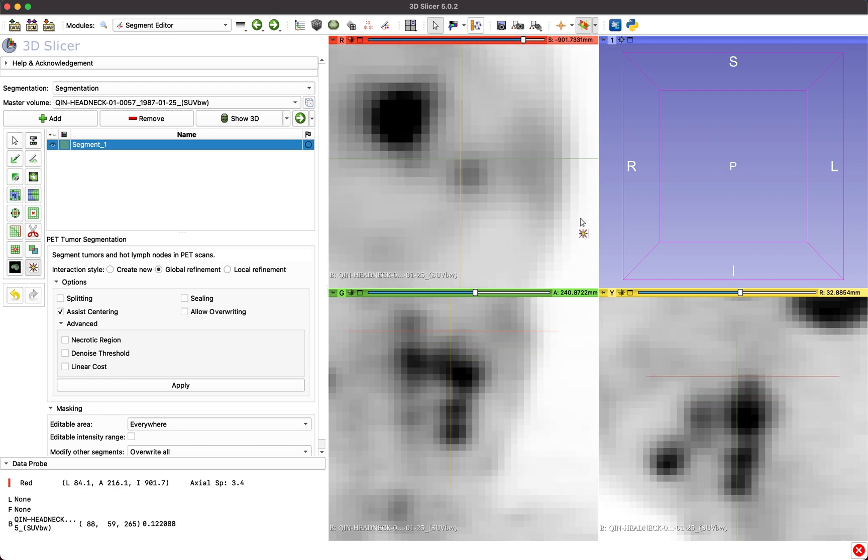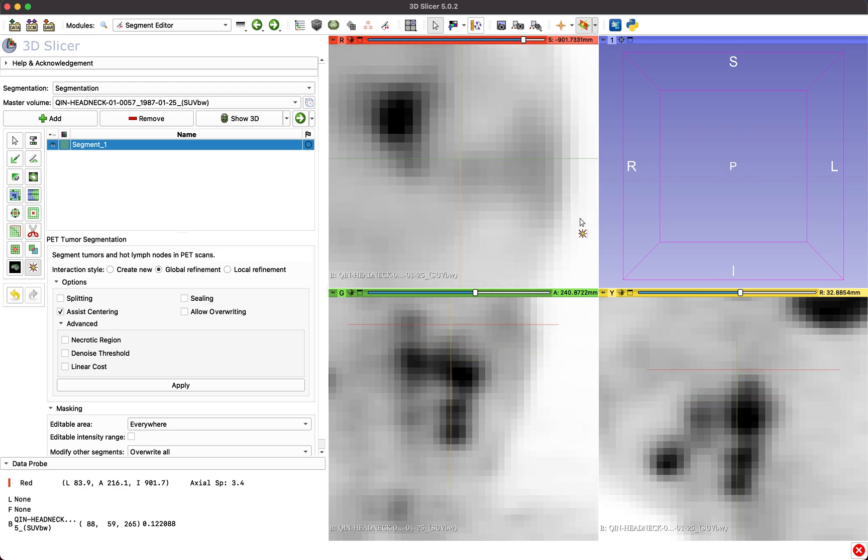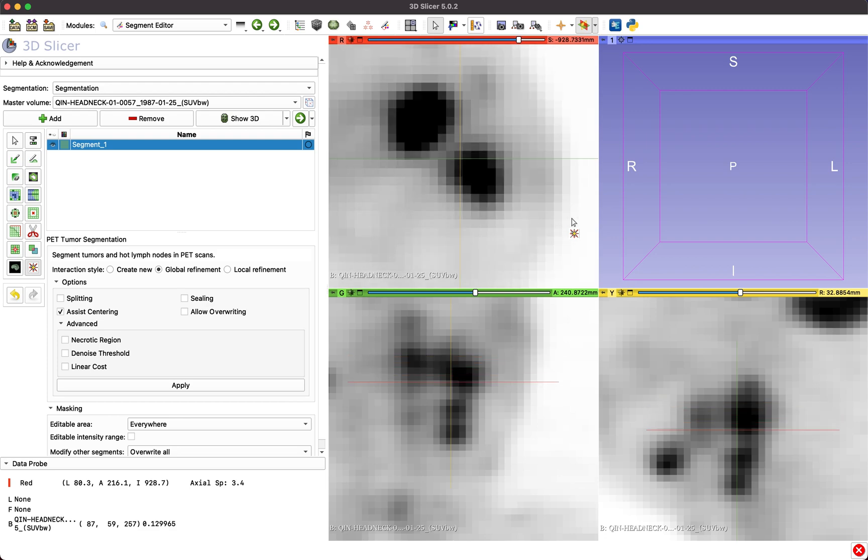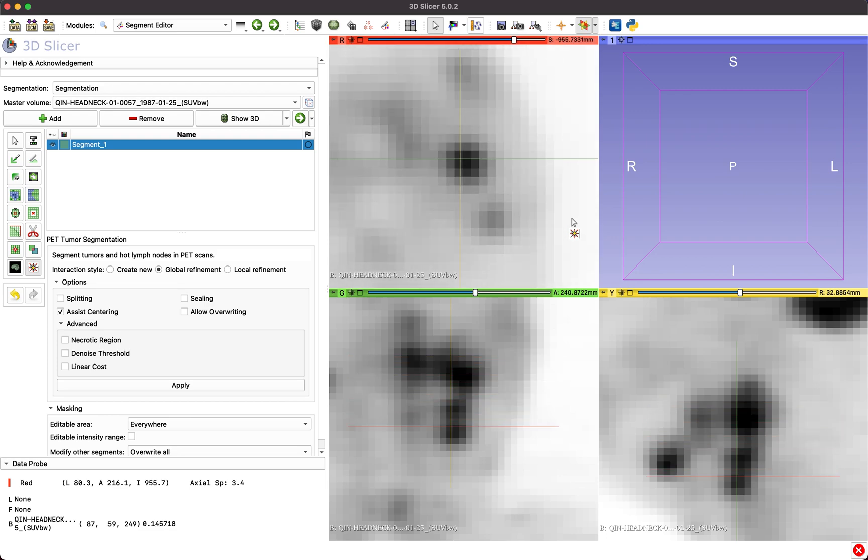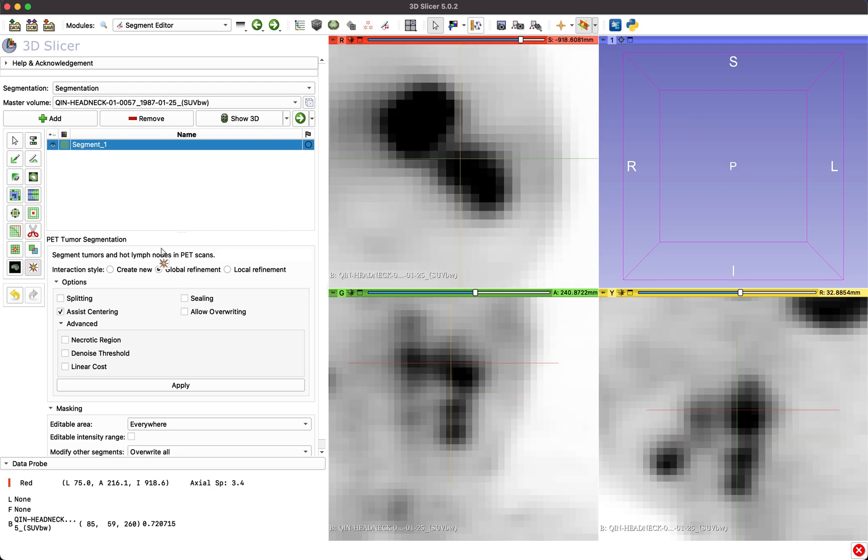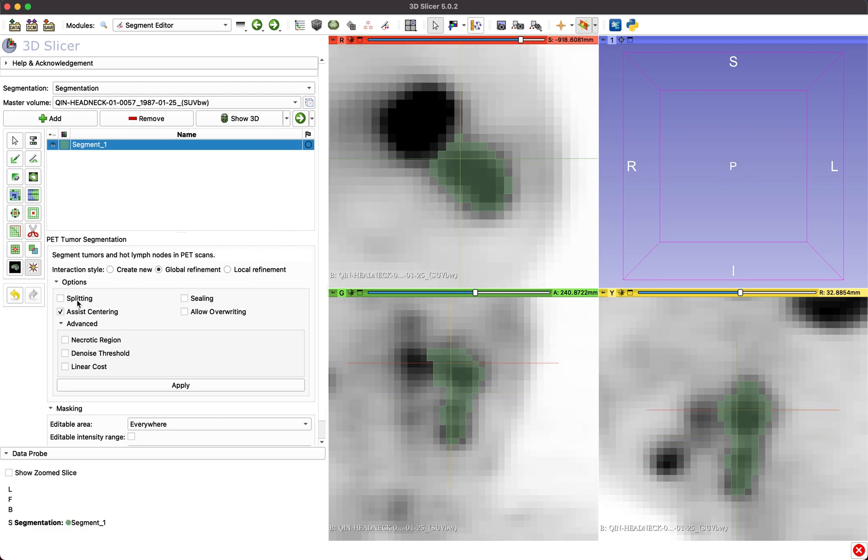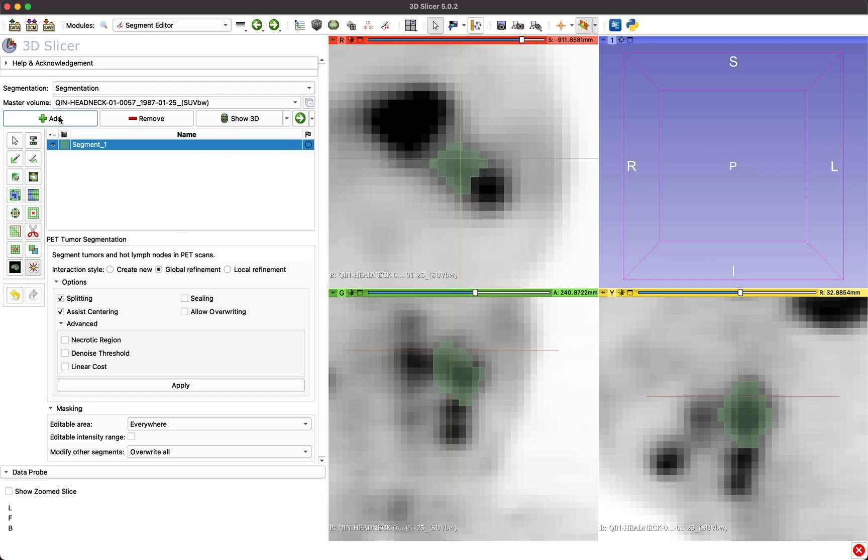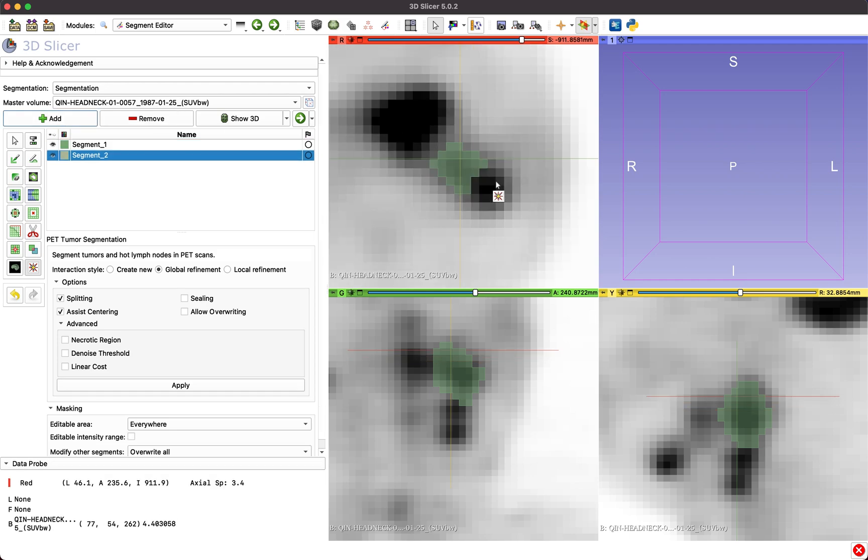Splitting is useful in cases of adjacent objects that need to be cut off. For example, in the case of lymph node chains. We recommend segmenting each lymph node in a lymph node chain separately, rather than in bulk.